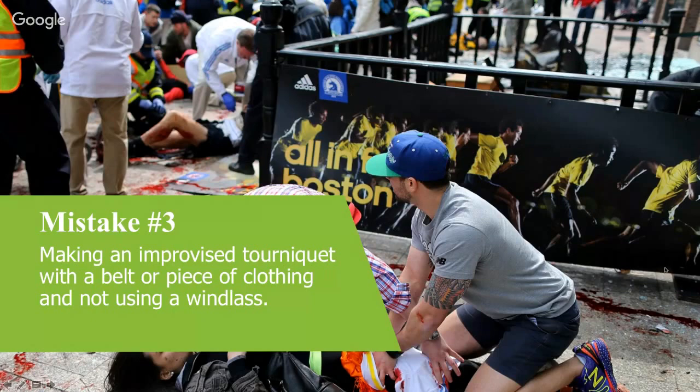My stance here is there's a whole range of appropriate devices to use as a tourniquet. There's some that the Committee on TCCC recommends, some that aren't yet recommended by the COTCCC but may be effective. And then, as we've demonstrated in our blog, you can make an improvised tourniquet. So I don't think we need to get bogged down in specific brands. It's the concept, and that is getting a tight band and then getting a windlass.